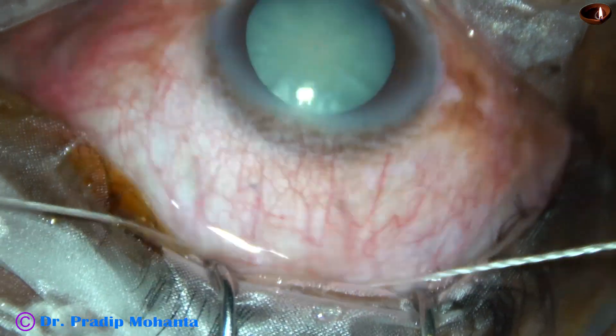The final step is putting the releasable suture at the right end of the peritomy. I will pull three loops — one, two, three. Hold the suture and pull. Just cut the longer thread close to the knot; keep the other thread a little longer. If you pull the longer thread, it will come out. This releasable suture can be removed after three to four days — I usually remove it at the next visit when the patient comes for refraction. See how good is the opposition of the conjunctiva. Thank you very much for your attention. Hope this video will help you in developing your SICS skills.